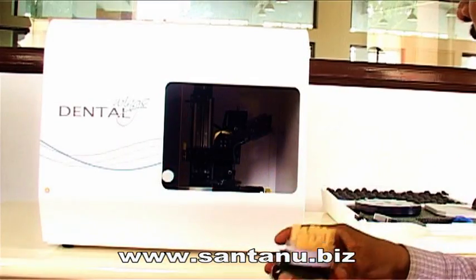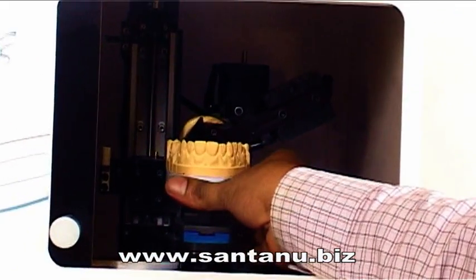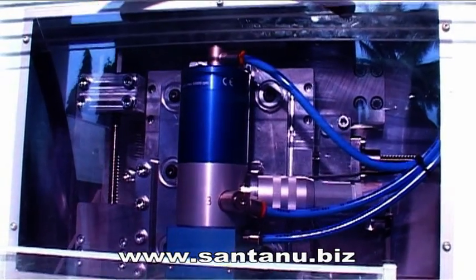A 5-axis laser scanner scans the dental dyes. The Zycon dental restoratives are manufactured with the finest precision, state-of-the-art CAD-CAM machines.